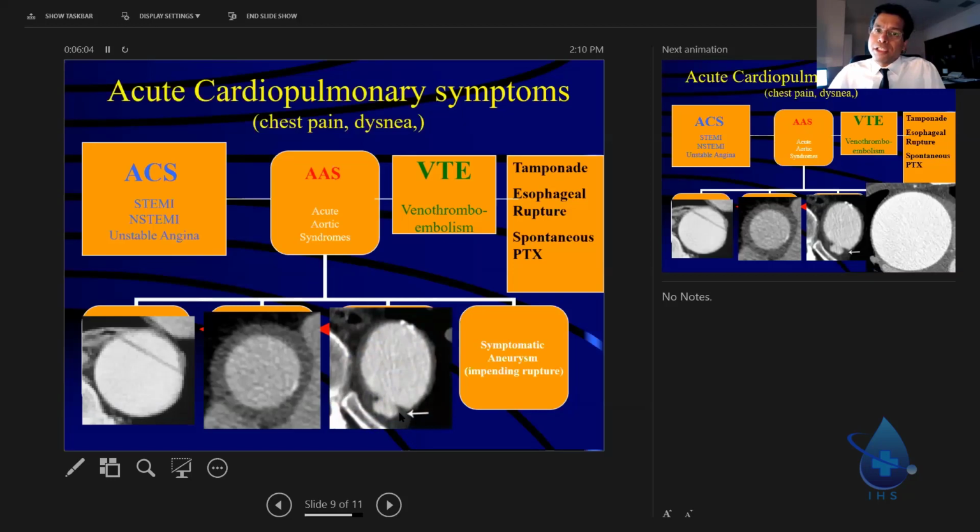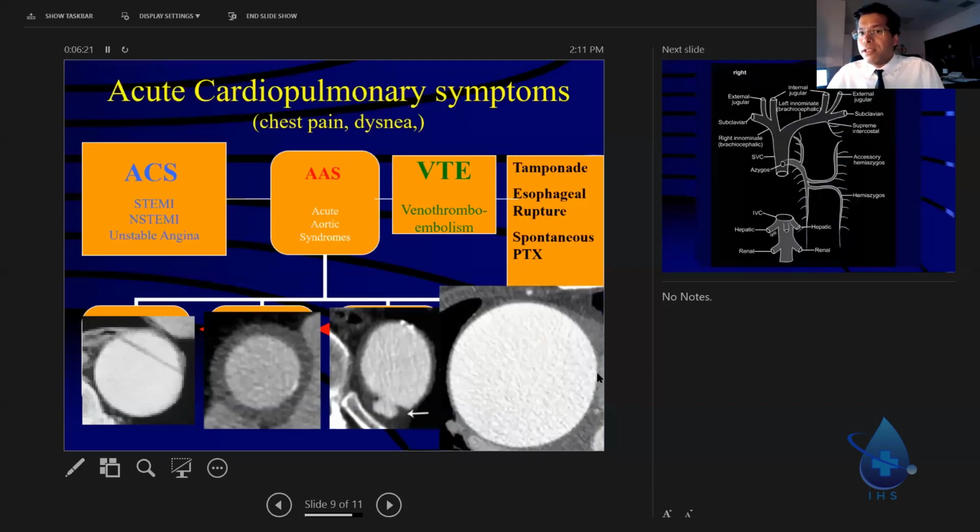Third, acute aortic syndrome is a penetrating atherosclerotic ulcer, and that is the imaging finding. You want to be very careful with your language here. The imaging finding is a contrast outpouching. Contrast outpouching. Okay. Fourth, large aorta, big aorta, okay, is a symptomatic large acute aortic aneurysm.